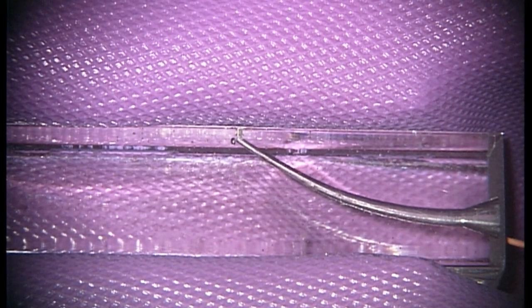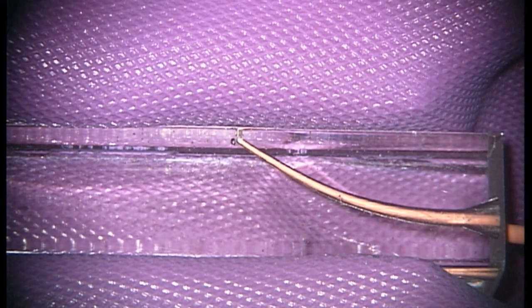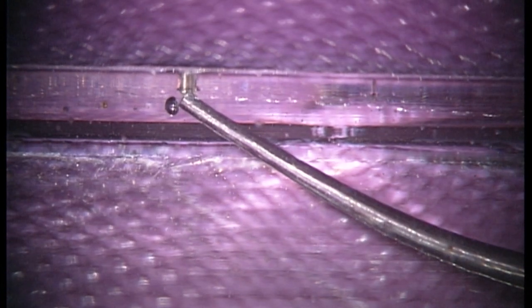Let's look at an obturation now in a plastic block. Here we take the System B tip and assess the length of the canal space, having primarily placed the GP cone to length and achieved tugback. This can all be done with hypochlorite in the clinical situation within the canal, which improves the level of disinfection and cleaning. We have a matching cone to match the tapered shape generated with our TF file systems, and we're now ready to adjust our plugger tip.